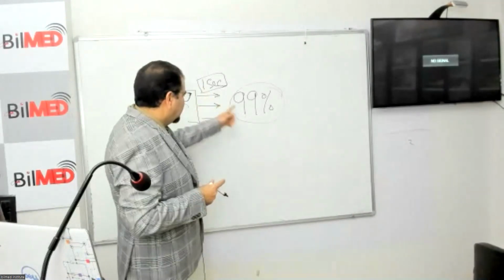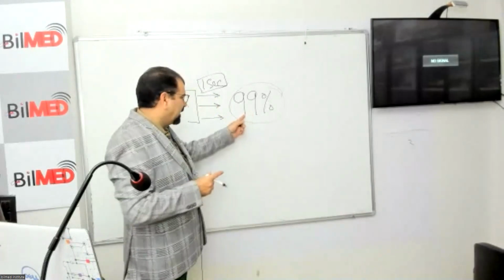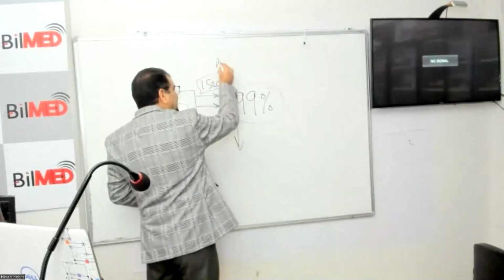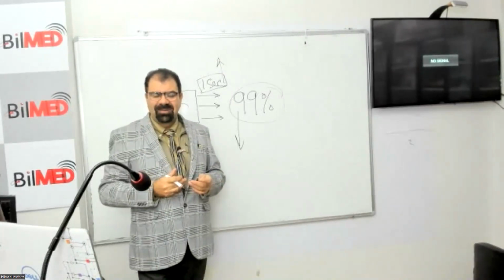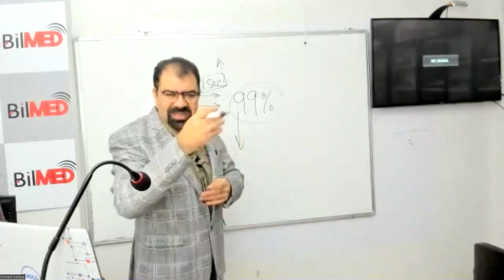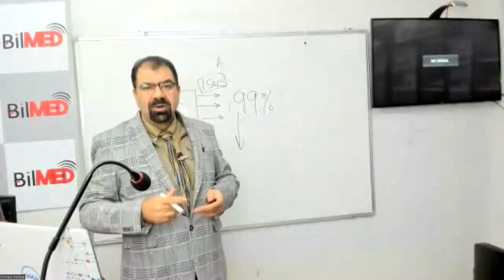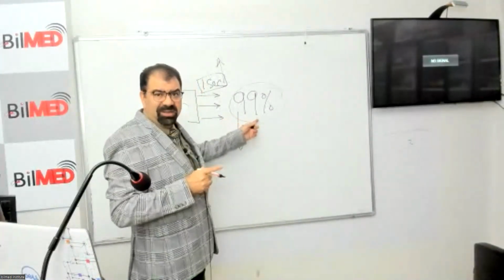Now, if I decrease this time, this listening period, what I am actually doing, I am increasing the working of machine. This is pulse repetitive frequency. How often I am sending the beam in the organ. Make a note here. More the listening period. This is physics.